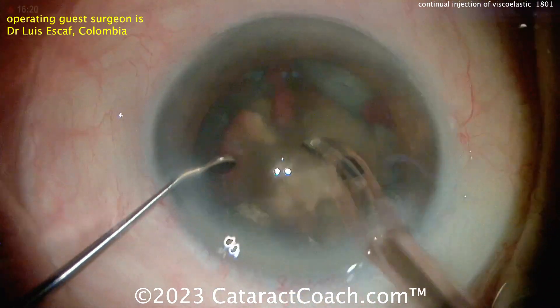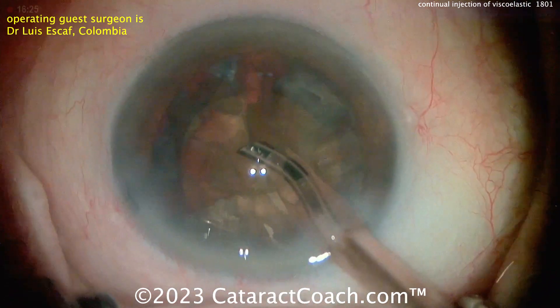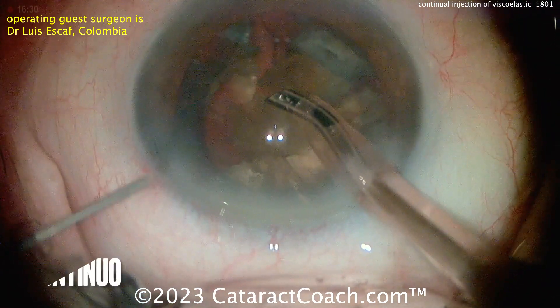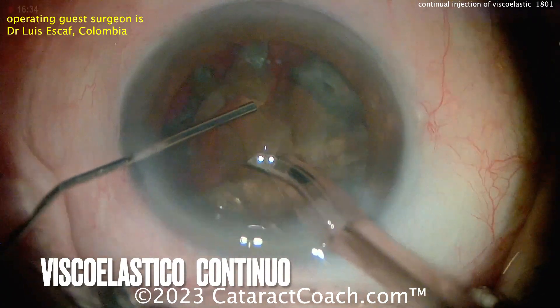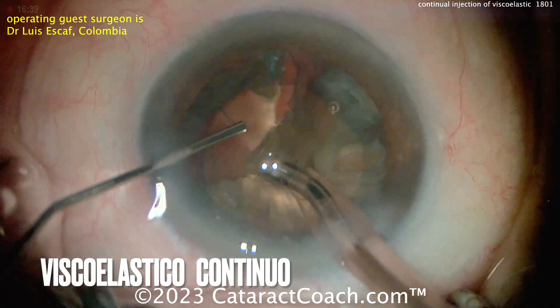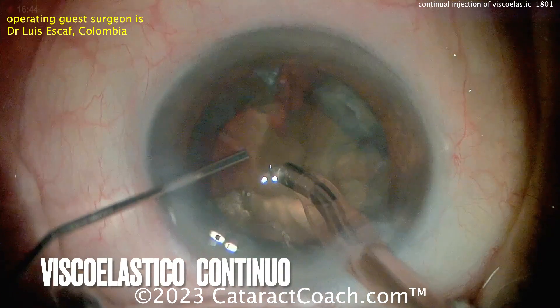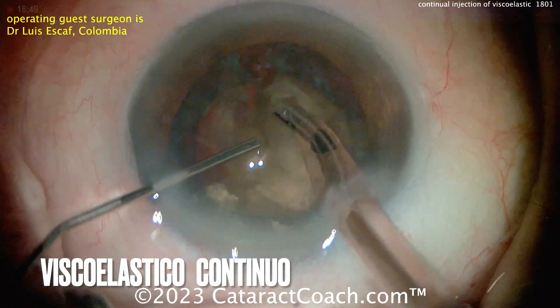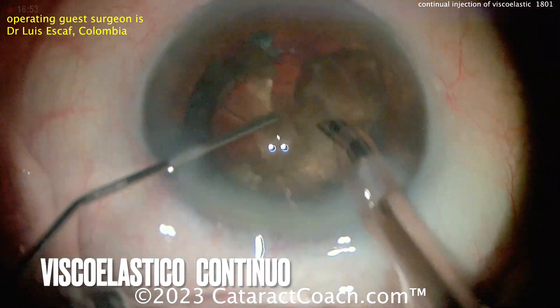Finally getting some light on that retina. You can see little peaks of that beautiful red reflex. Taking down these pieces. And now it's going to come in with the injection of viscoelastic — there it is. This I thought was brilliant too: continuous injection of viscoelastic, a little bit at a time, small aliquots. You don't have to do a ton of it. Be careful — you don't want a wound burn, you don't want the viscoelastic to clog up the tip. But using this viscoelastic, injecting little aliquots at a time to help preserve that corneal endothelium, protect it, and then also getting behind the piece and injecting it behind the nucleus and in front of the posterior capsule.